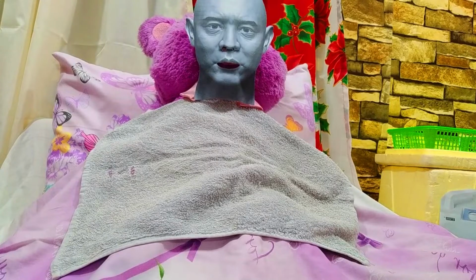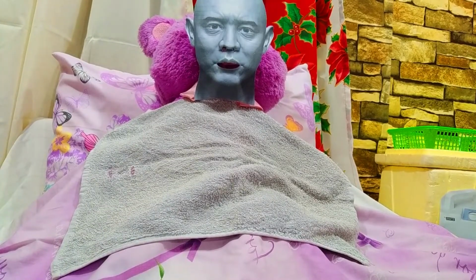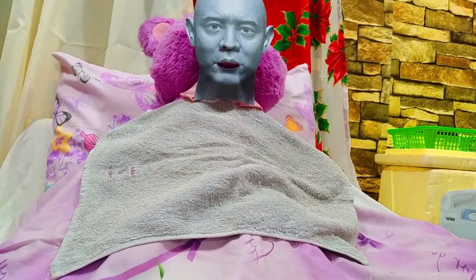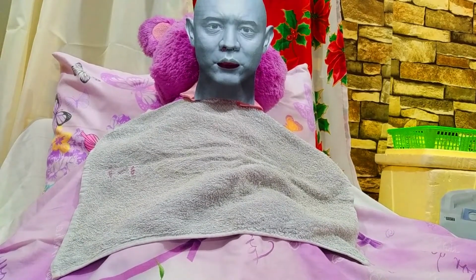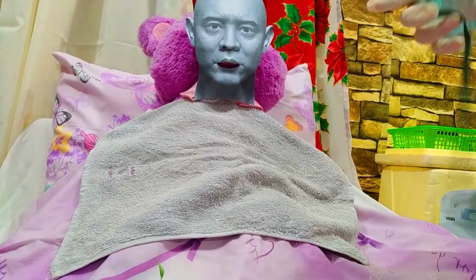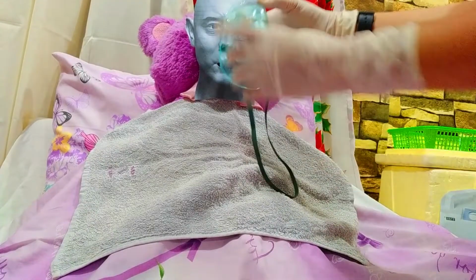Then we need to replace the oxygen delivery device using the non-dominant hand if appropriate and allow the patient to take several deep breaths.